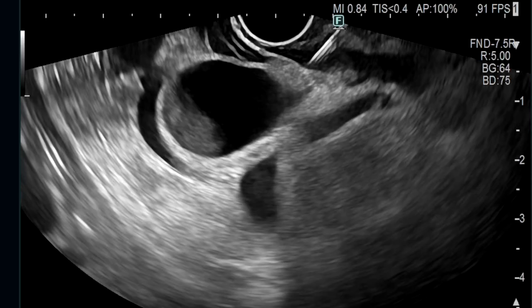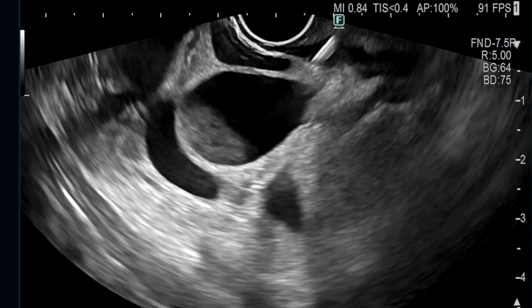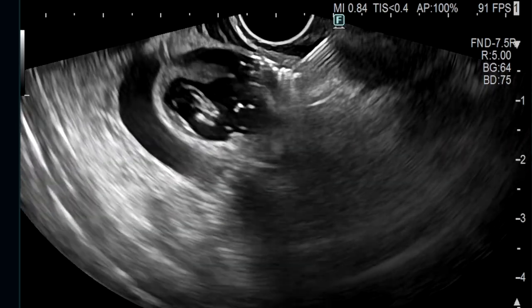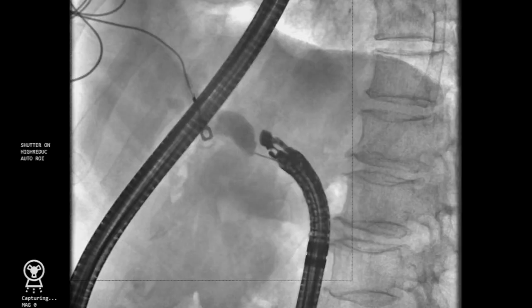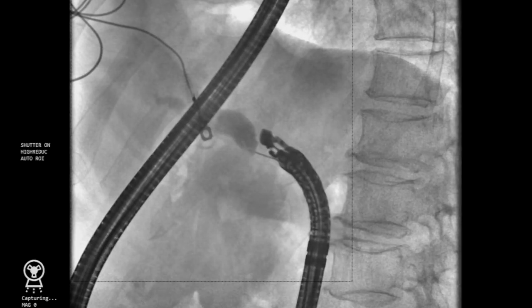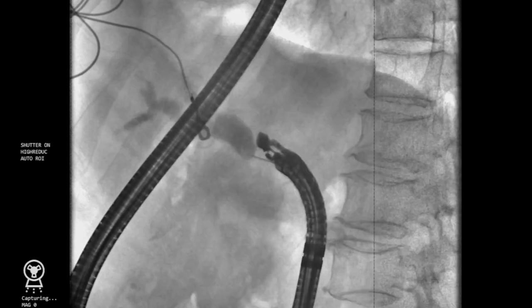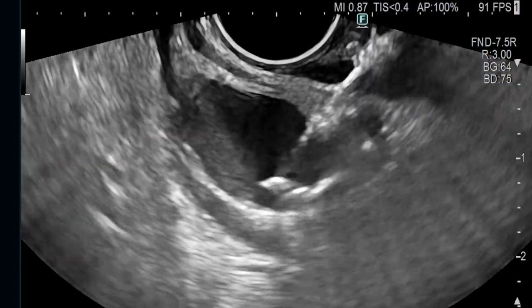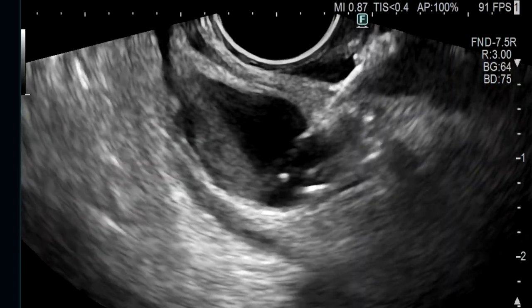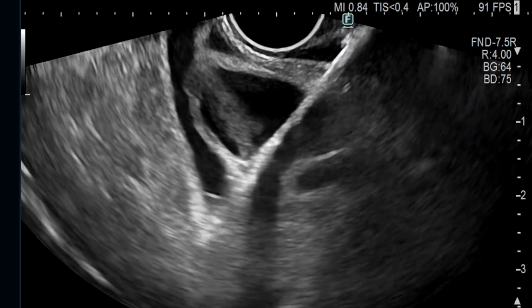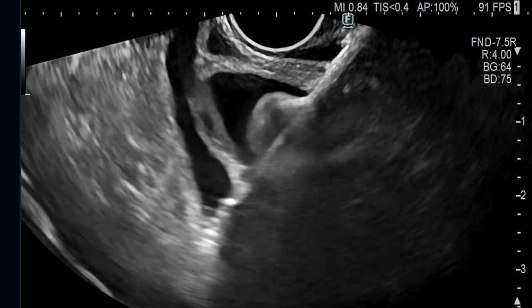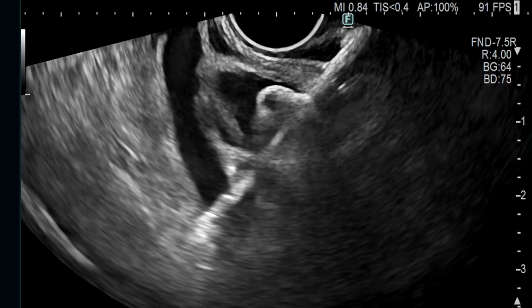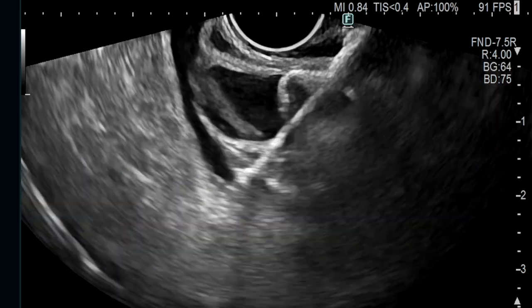A cholangiogram was first obtained by injecting contrast into the bile duct using a 19-gauge FNA needle, in order to distinguish the cystic duct from the common bile duct. The bile duct was then directly punctured from the duodenal bulb using the tip of the electrocautery-enhanced delivery system of the hot AXIOS lumen-apposing metal stent.